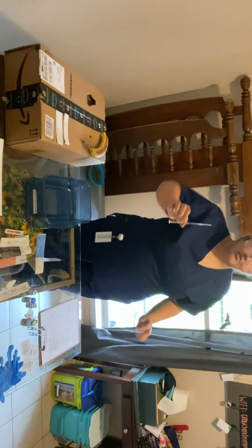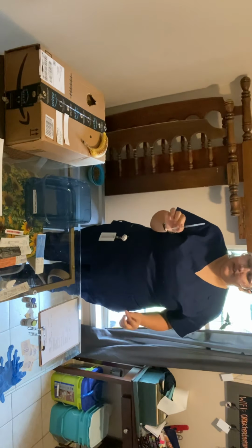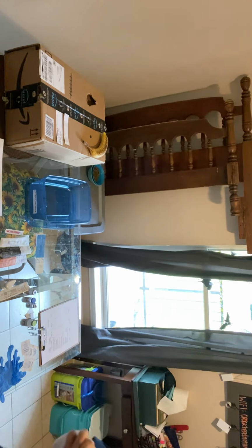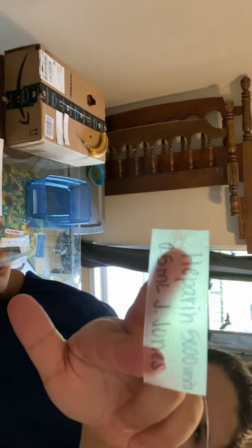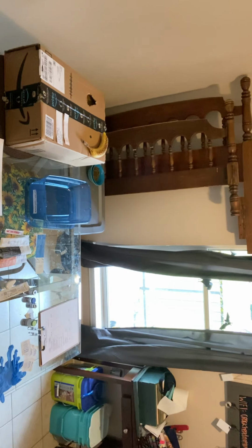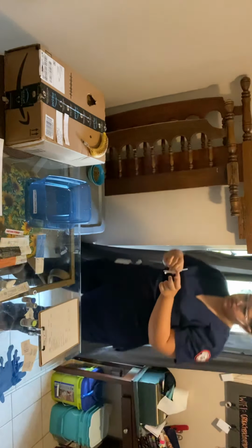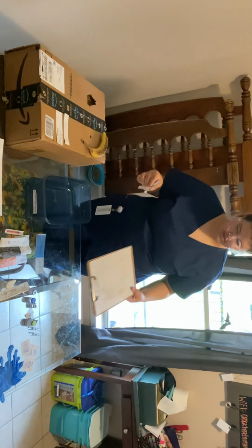And once I have completed drawing 0.5 milliliters of heparin, I will then add a label. So I've made a label and I can show that for the camera as well. Heparin, 5,000 units, 0.5 milliliters, and I have Jaguar Jones on there. I'm just going to stick that onto the medication, and I would then take my MAR and my medication to the patient's bedside.